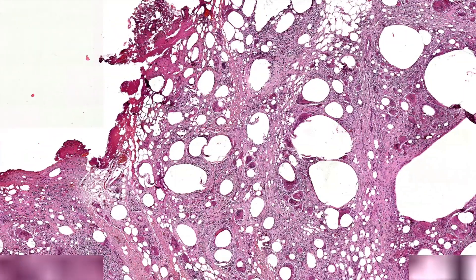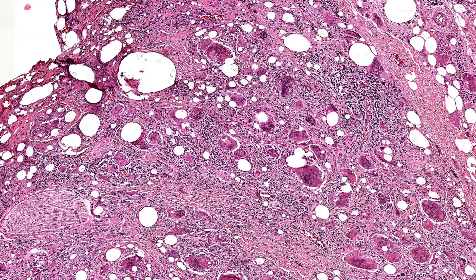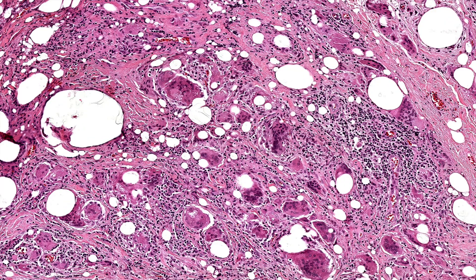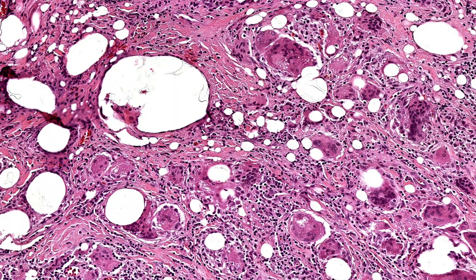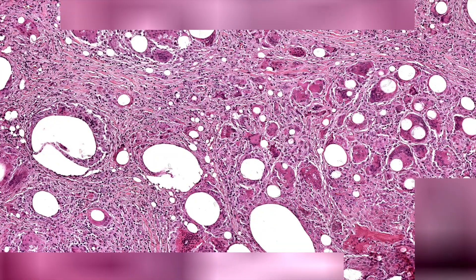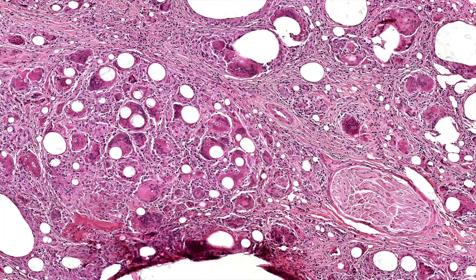If you look around, you will usually find asteroid bodies. The best time to see asteroid bodies is not in sarcoidosis — despite the teaching that everyone gets in med school. The best asteroid bodies I see are actually in the setting of foreign body granulomas. This is the prime hunting grounds for asteroid bodies: foreign body granulomas.